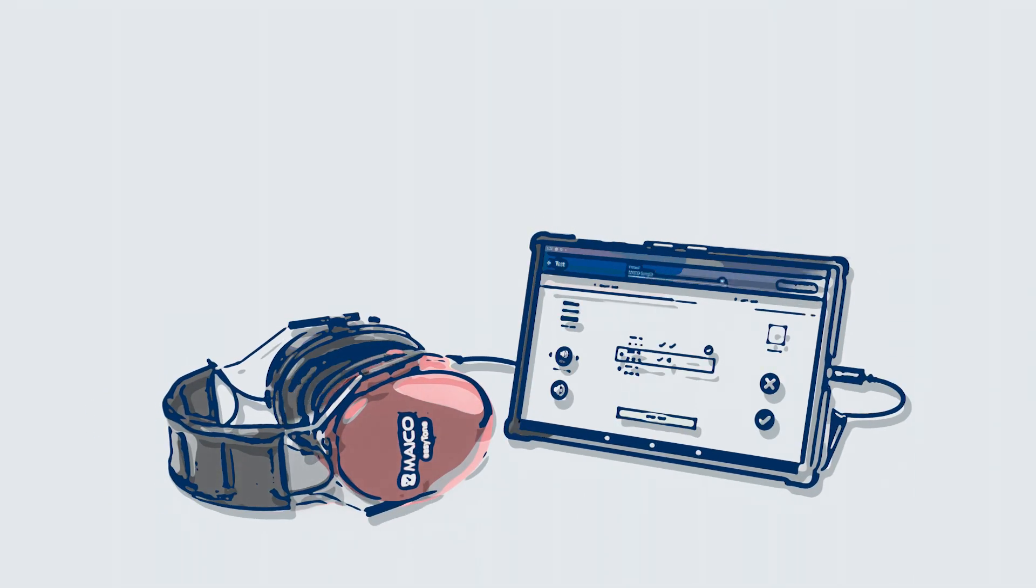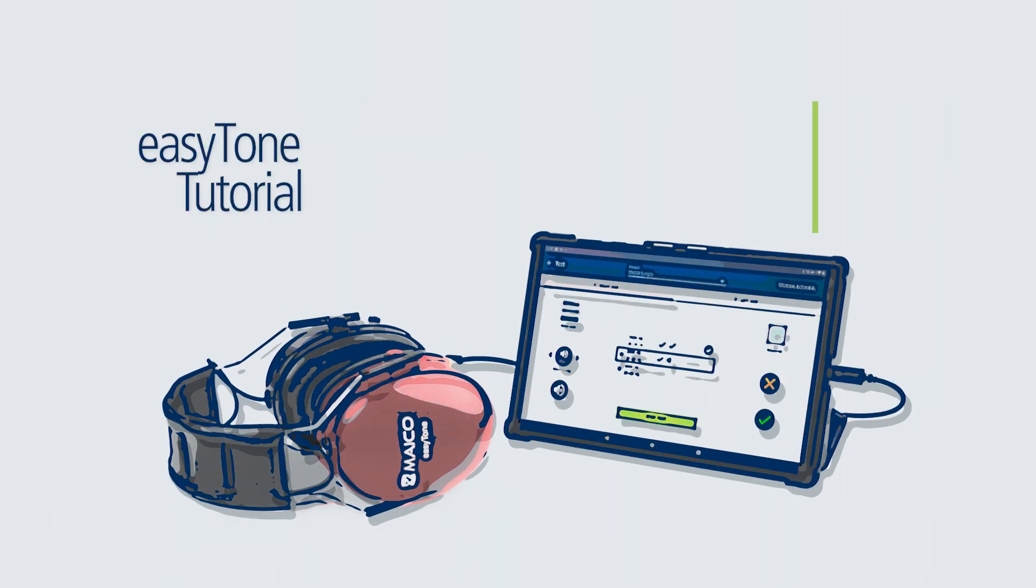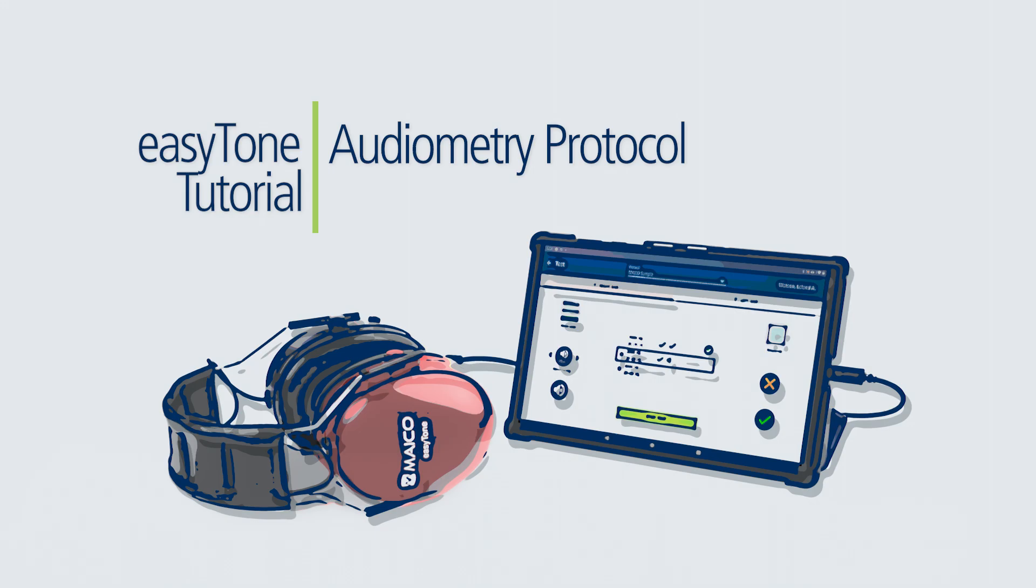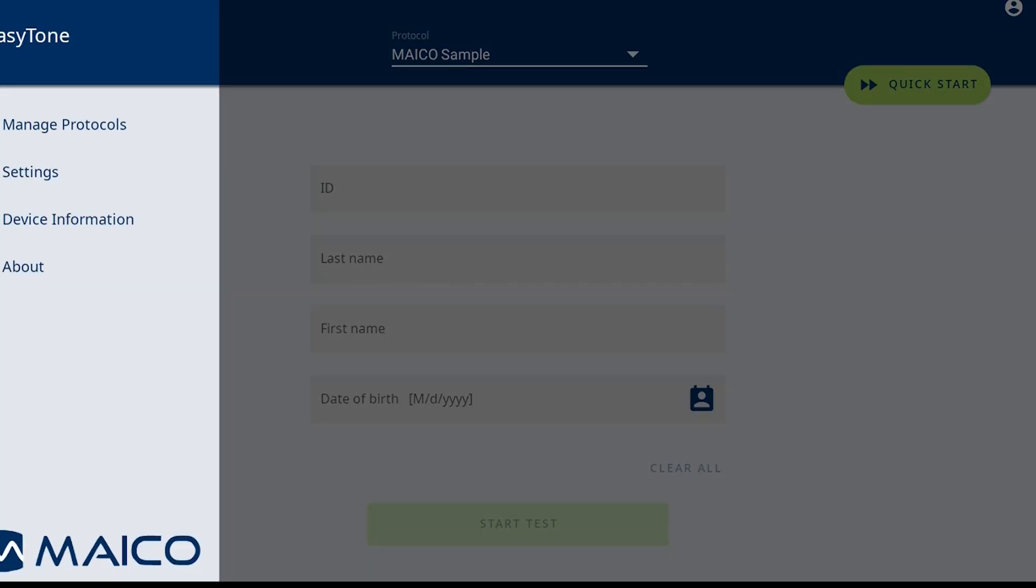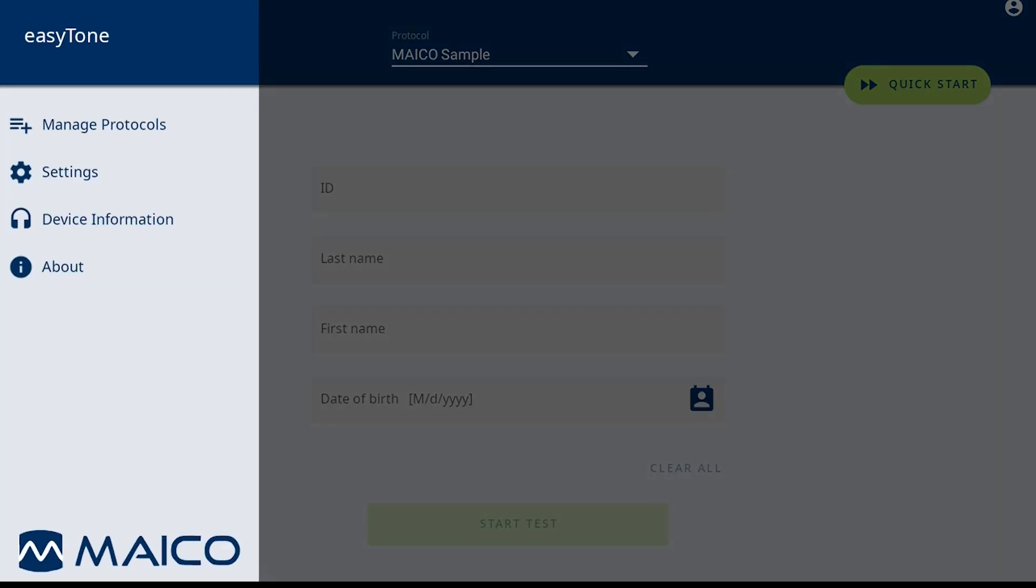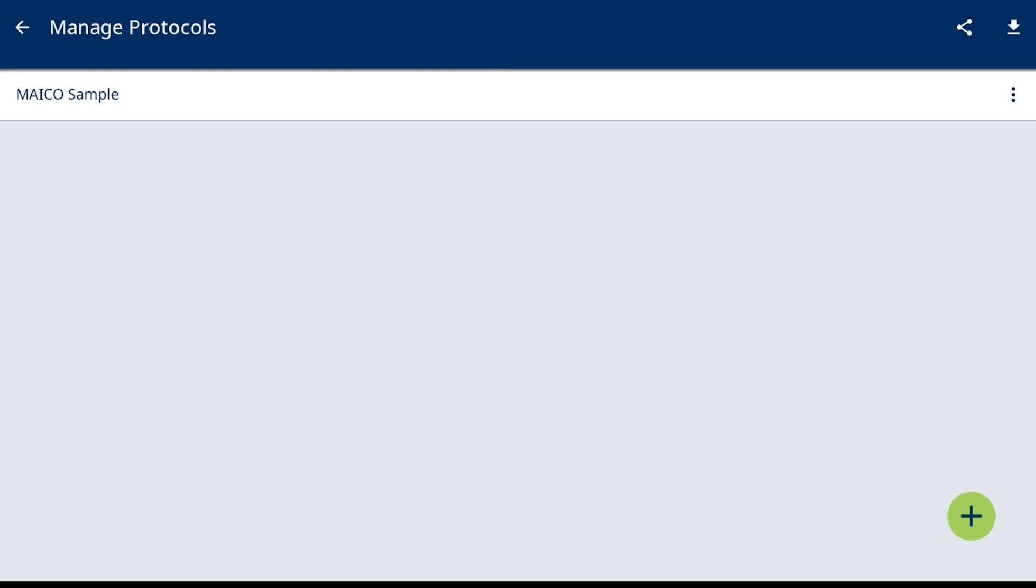This tutorial is to review creating a pure-tone audiometry protocol. To create a protocol, select the hamburger menu at the top left corner. Select Manage Protocols and a demonstration MAICO Sample protocol is listed.